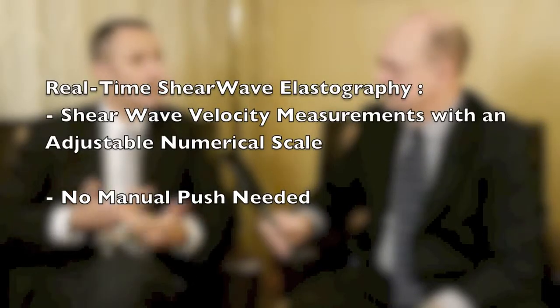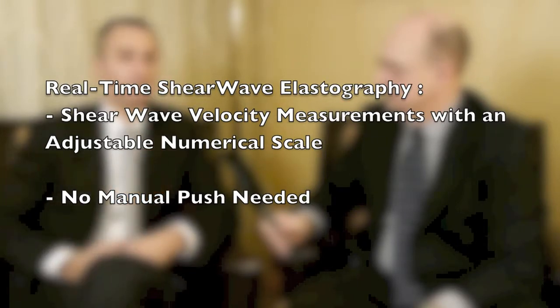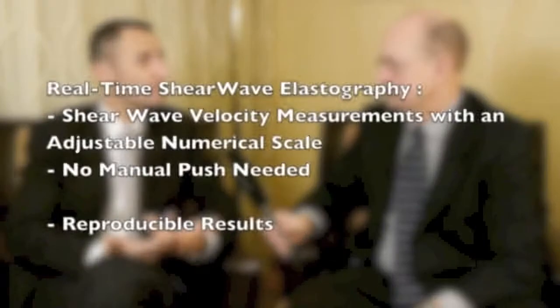So you do not rely on any motion of the transducer, any pressure of the transducer, which is what you do when you do static elastography. What you just want to do is to gently apply the transducer, and the ultrasound will generate the constraint in a reproducible way every time.